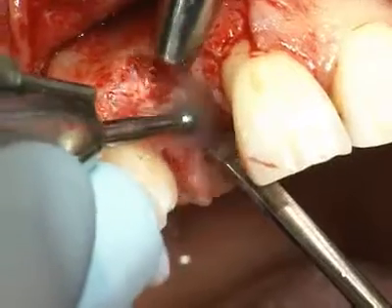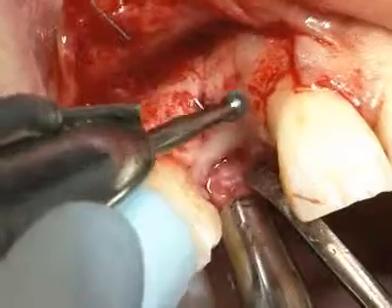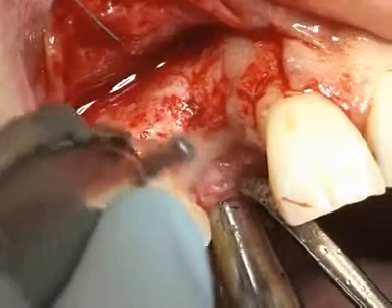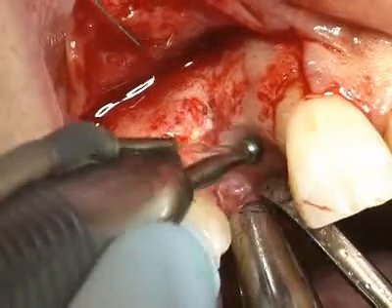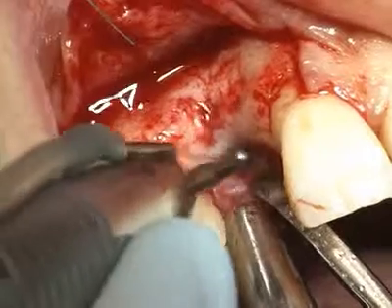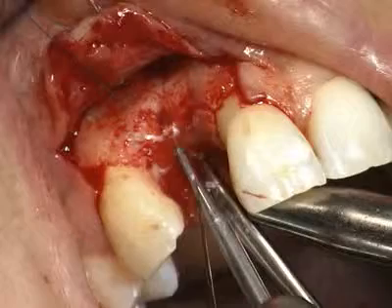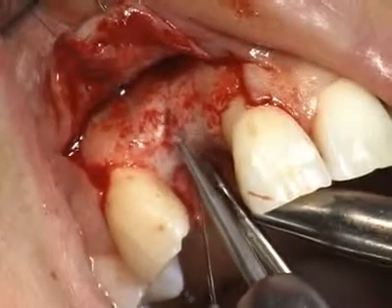The site plan for insertion of the implant is now smoothened and flattened using a large round burr at a maximum speed of 800 rpm, cooling it with sterile saline and reducing the height of the bone only slightly. The implant position is then marked with round burrs of increasing diameter at a speed of up to 800 rpm with cooling.